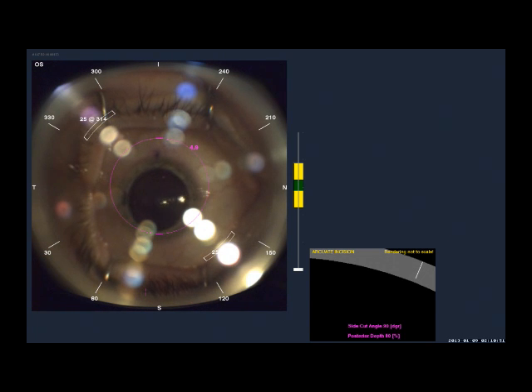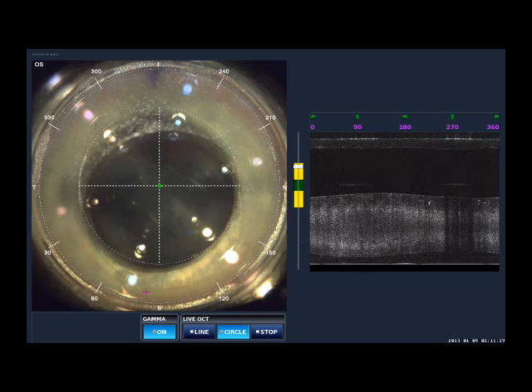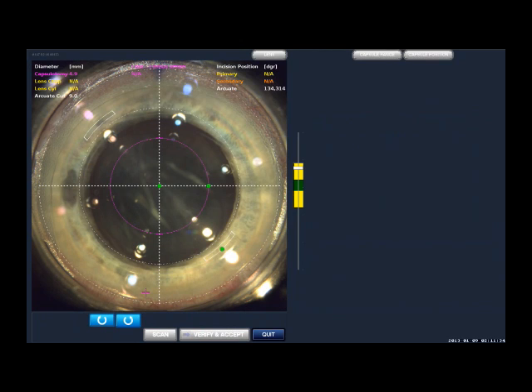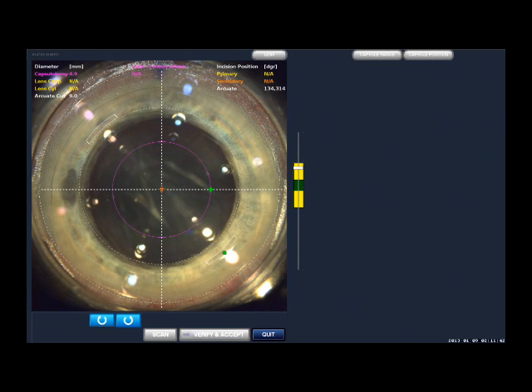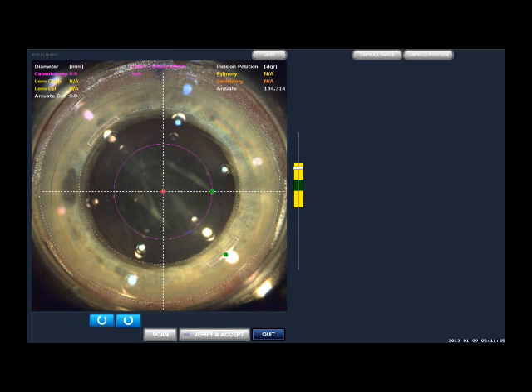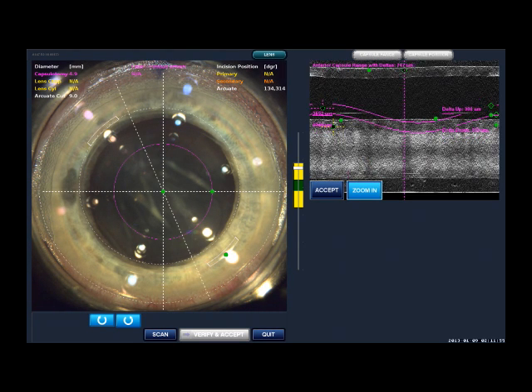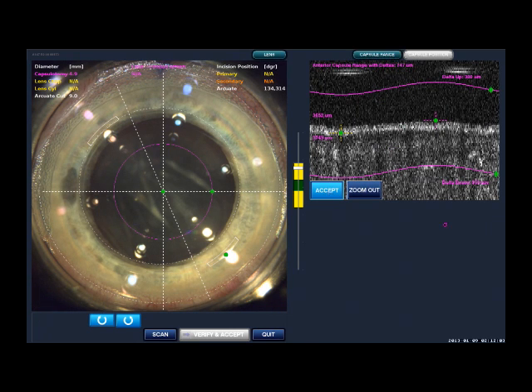You'll see this is the docking of the laser, and on the left side of the screen we see engagement by the suction cone to the surface of the eye. This allows the eye to be held still during this initial portion of the procedure. The pink line there is outlining the planned capsulorhexis size, and in this particular case it measures 4.9 millimeters in diameter.